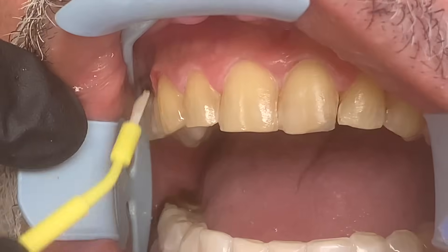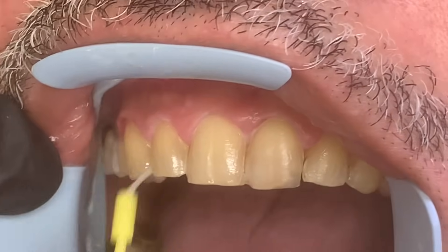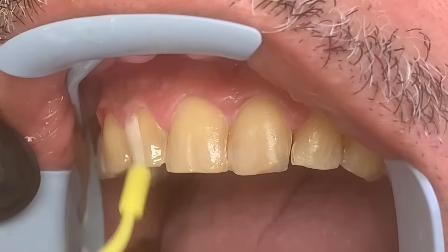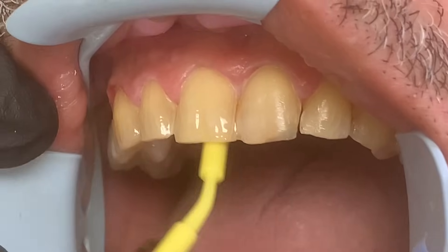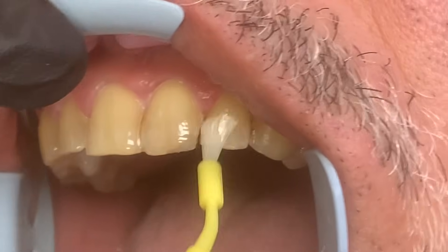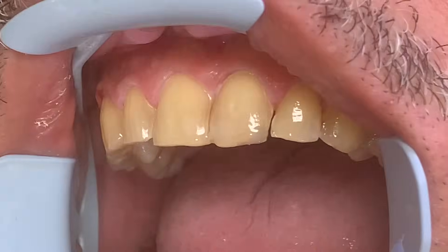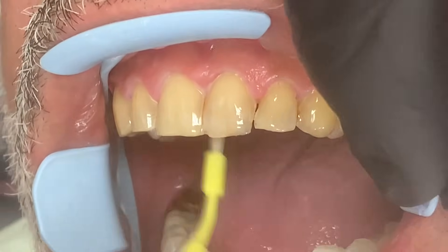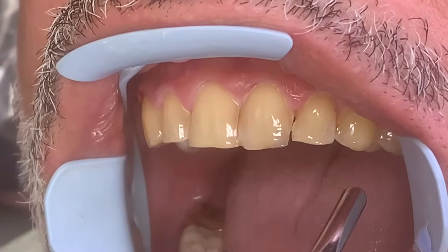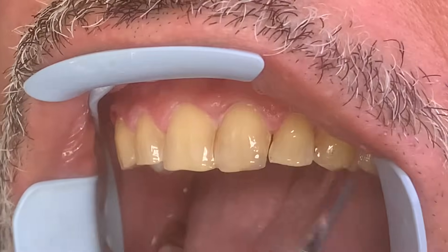This is the bonding agent — it's clear — and this is what is going to allow the veneer to adhere to the tooth. Then we will go in and light cure this, and then we will start to place the veneers systematically. We'll blow these out a little bit, just a very thin layer in, and then we'll light cure. Each tooth is light cured — we light cure the outside of the tooth and then the inside.